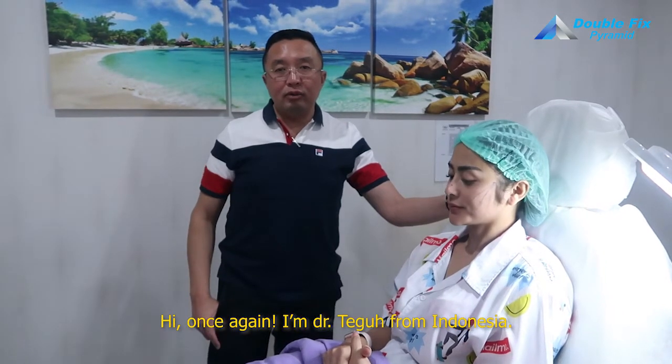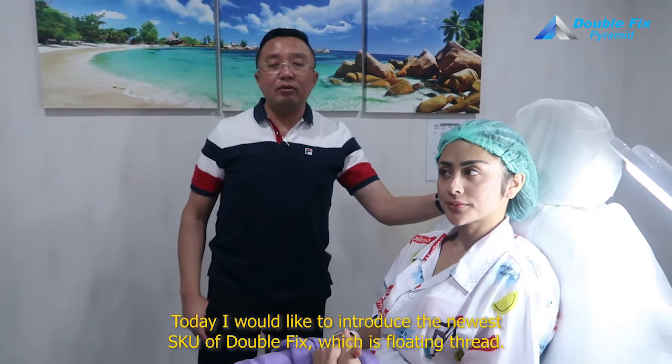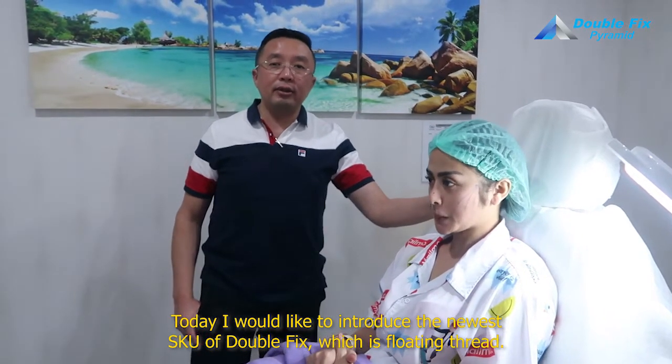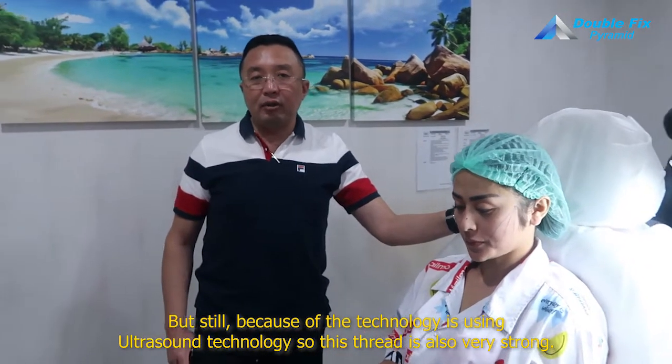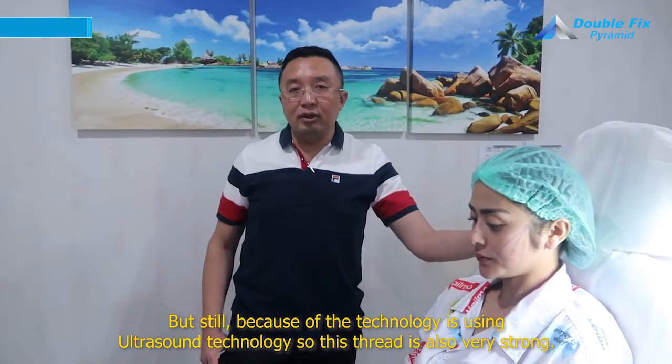Hi, once again, I'm Dr. Taku from Indonesia. So today I would like to introduce the newest SKU of Double Fix, which is a floating thread, but still because of the technology, it's using ultrasound technology.